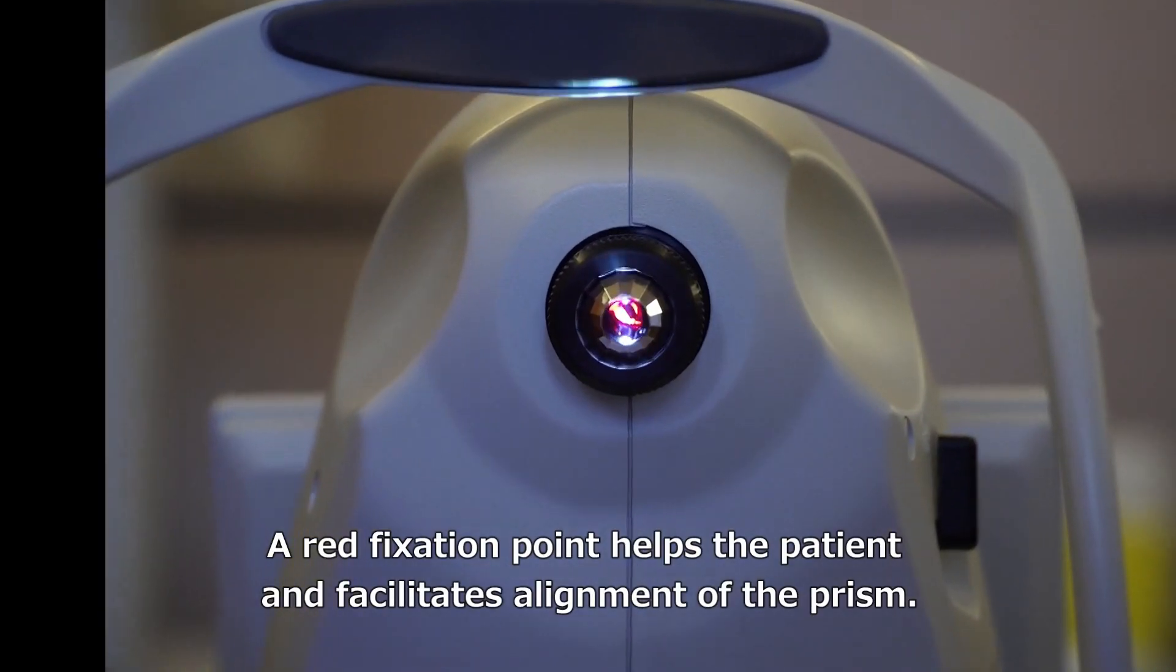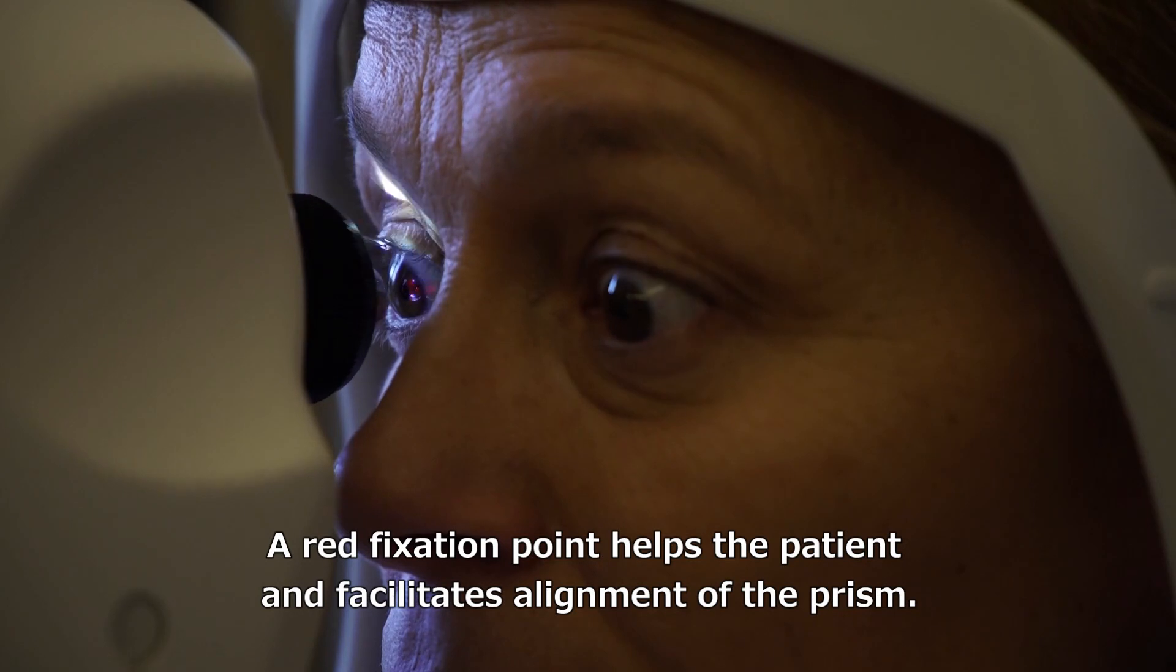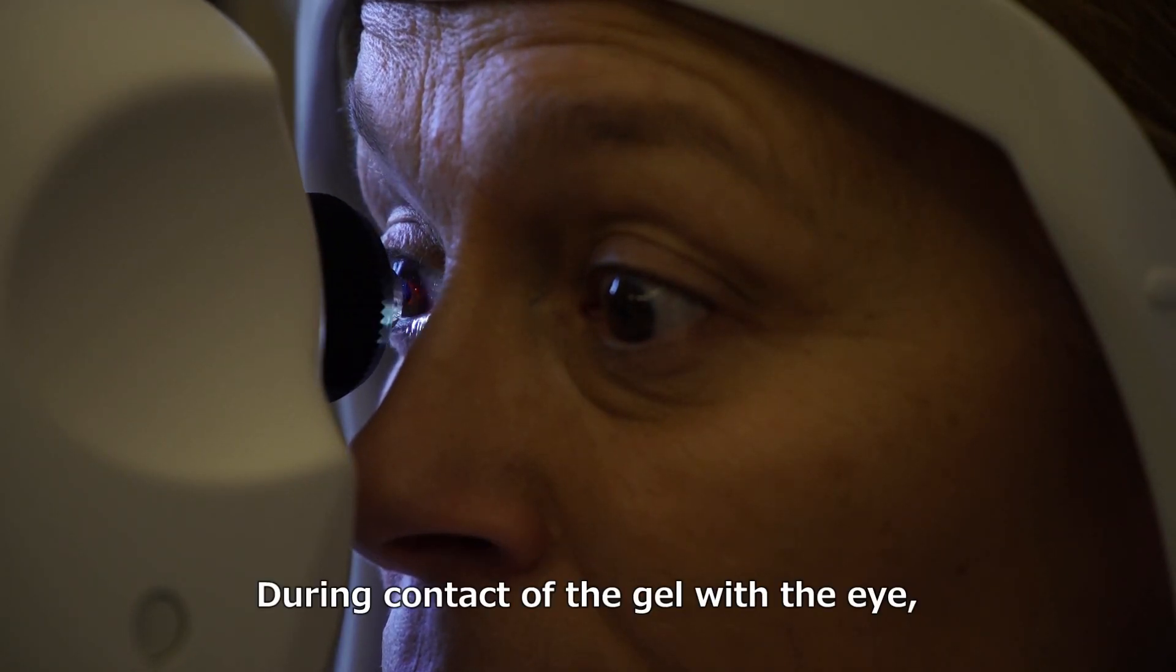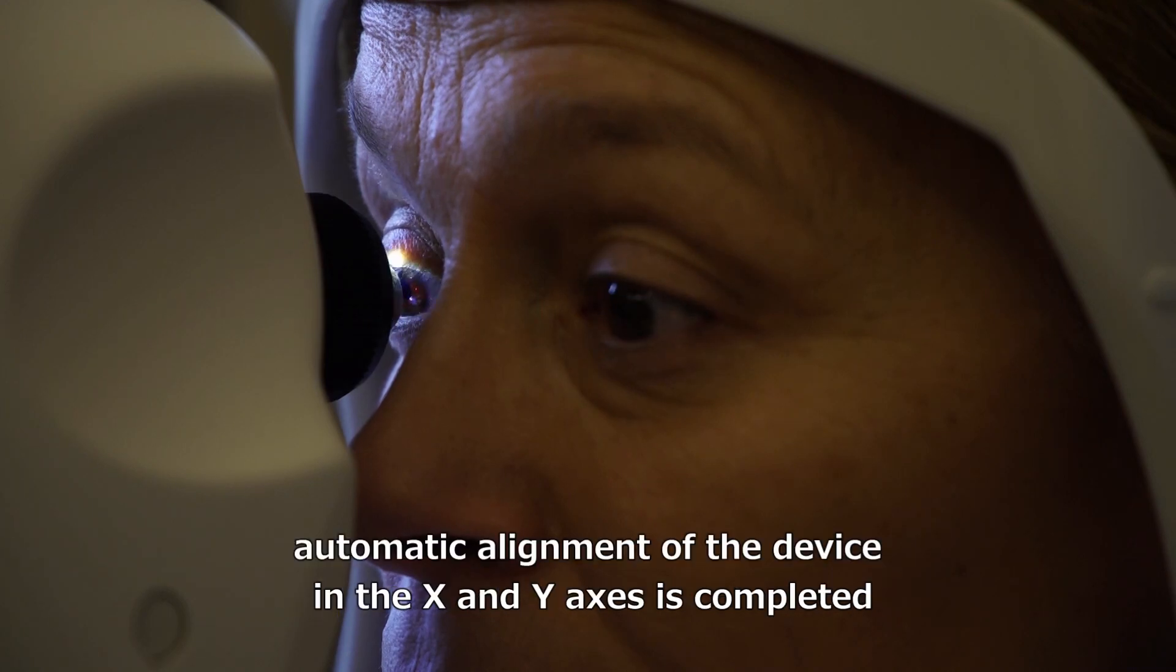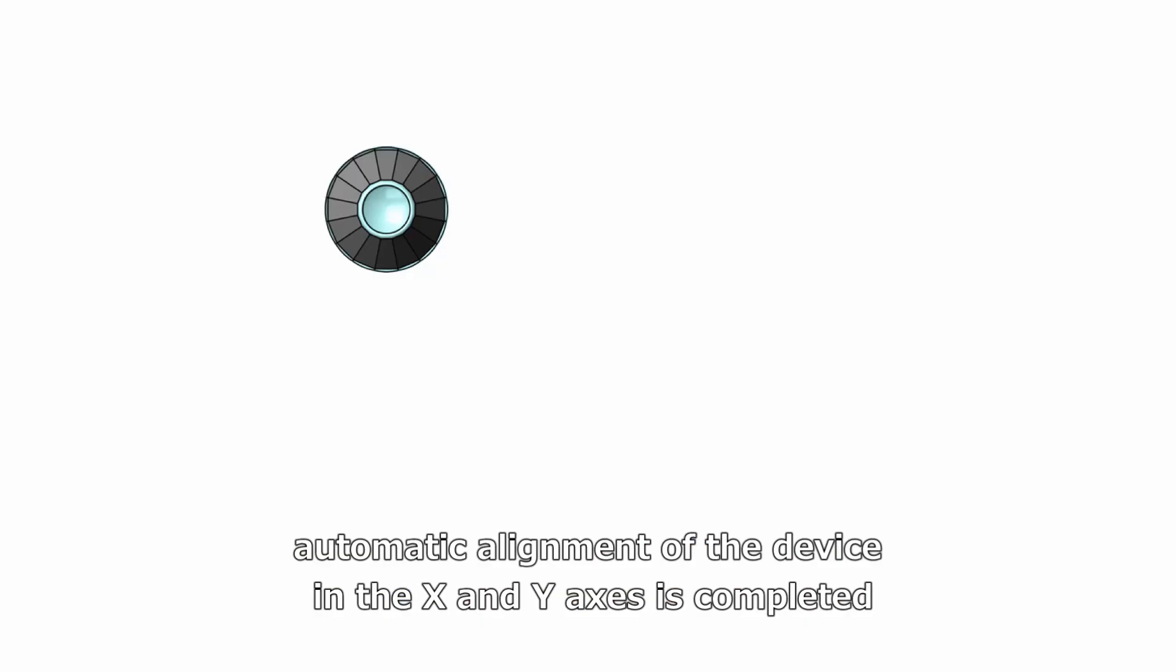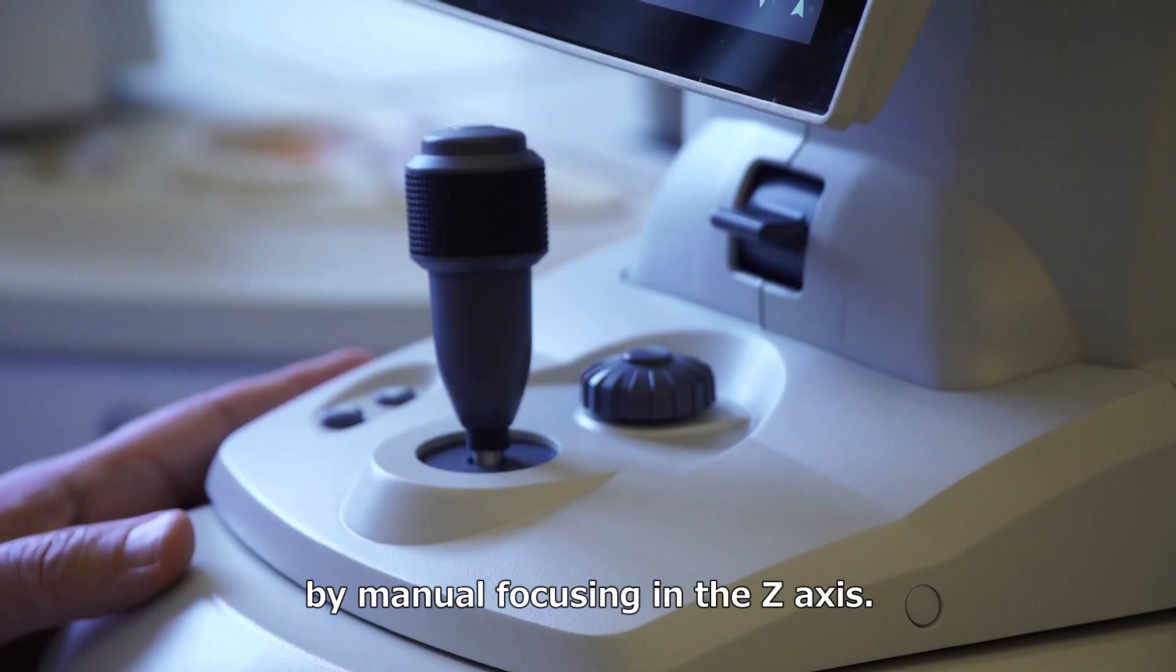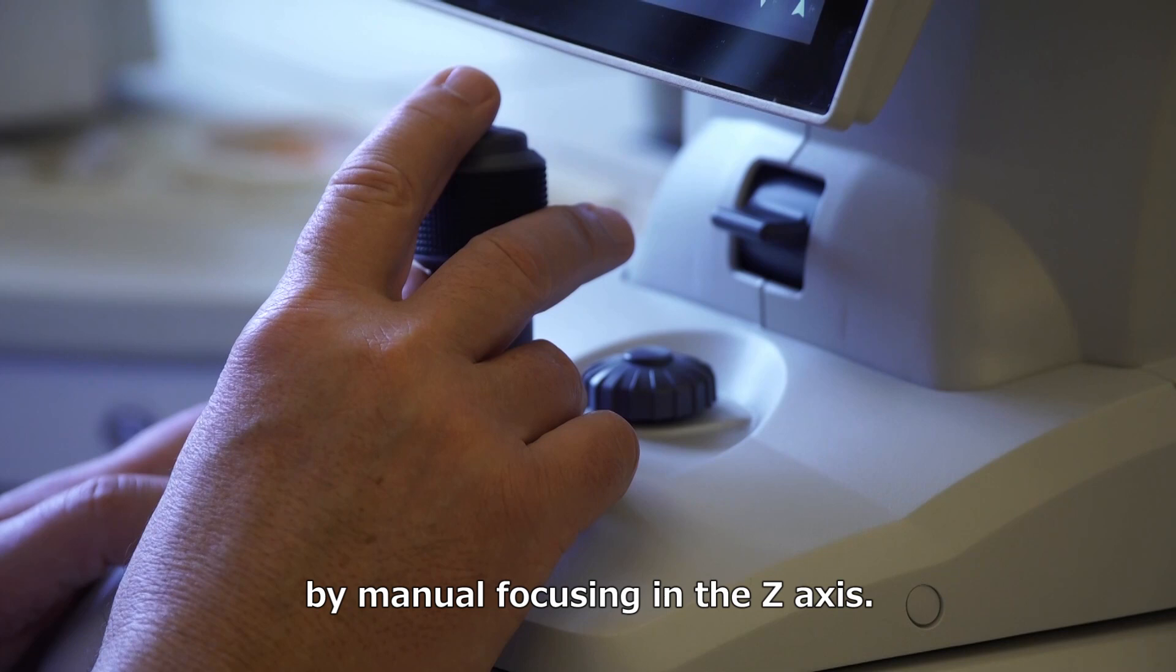A red fixation point helps the patient and facilitates alignment of the prism. During contact of the gel with the eye, automatic alignment of the device in the X and Y axis is completed by manual focusing in the Z axis.